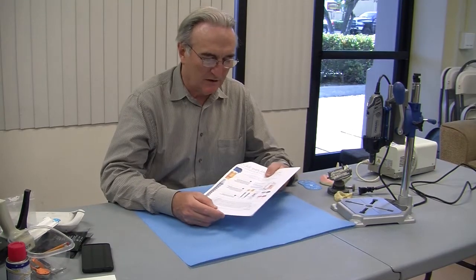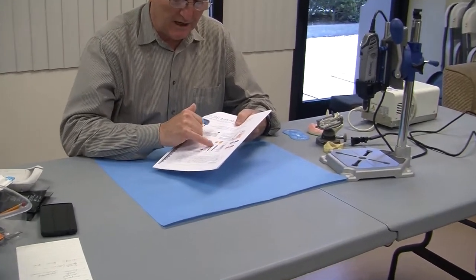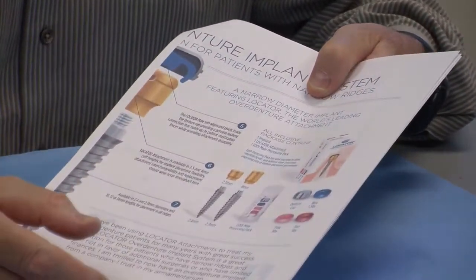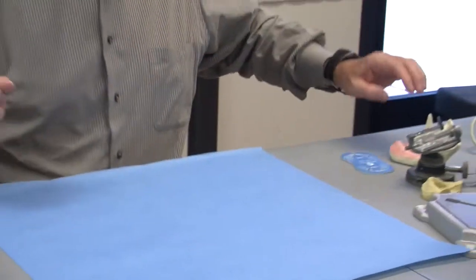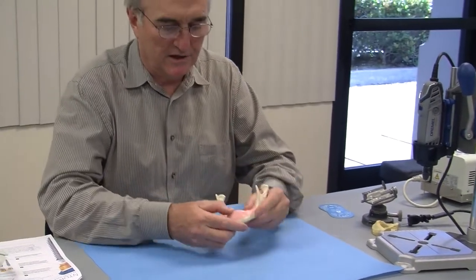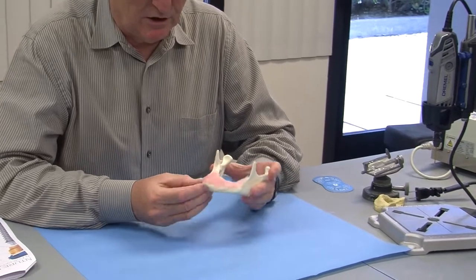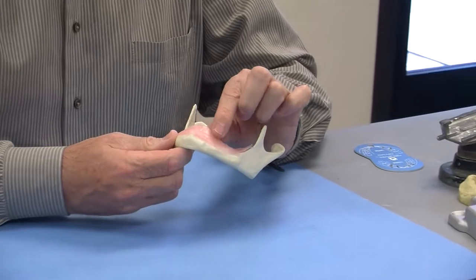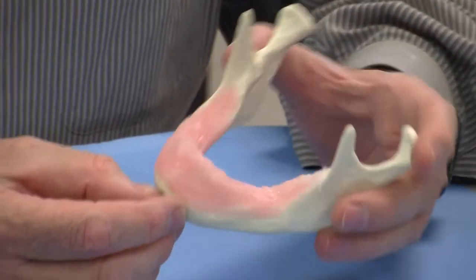How to place the Zest mini implant, 2.4 millimeter diameter, designed for locator attachment on a fully edentulous patient. The patient we are using today is not a real patient. It's a patient which has an edentulous mandible, and most of those patients have a reduced ridge height or width.